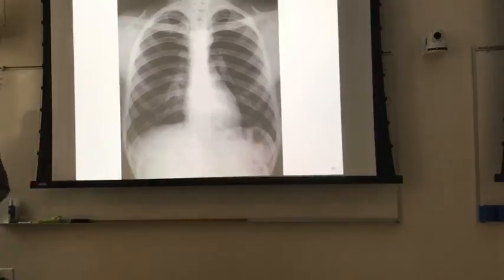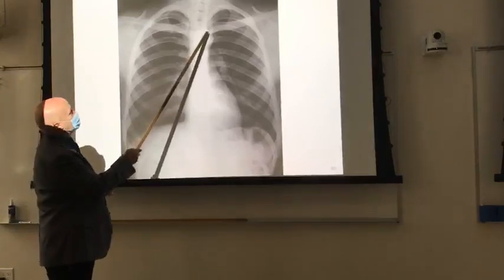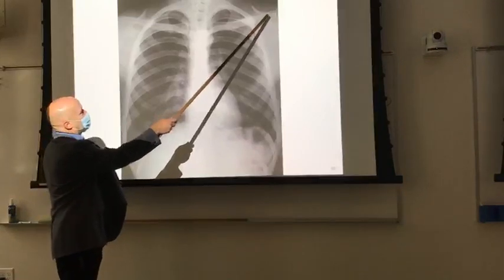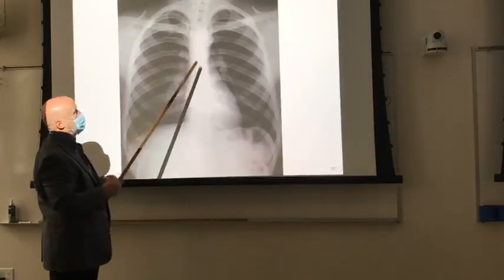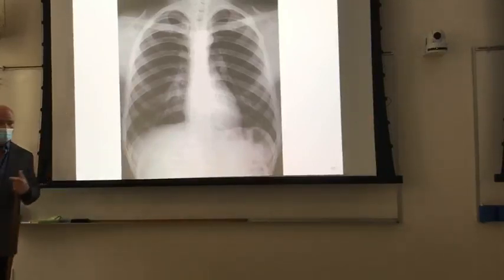All right? So what else do we want to see? Any rotation? No. How we determine rotation is also by looking at the clavicles. See the way the clavicles appear to touch the spine? You can follow the clavicle in, and this is the edge of the clavicle, and that's the spine. See the way it looks like it's almost in contact with the spine?